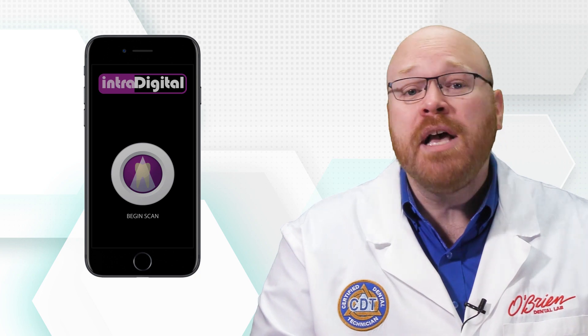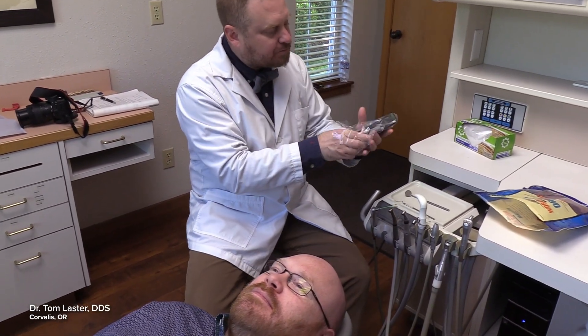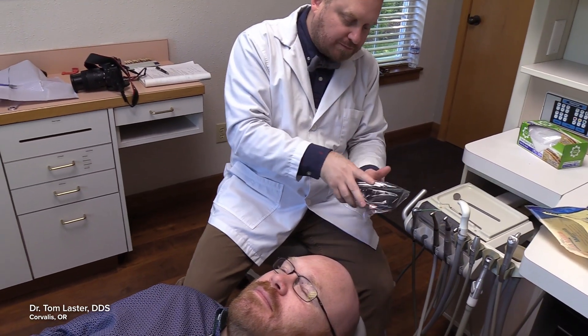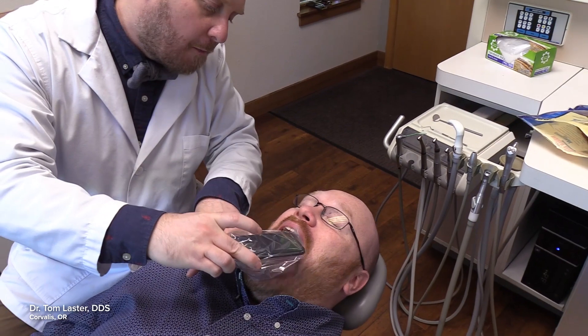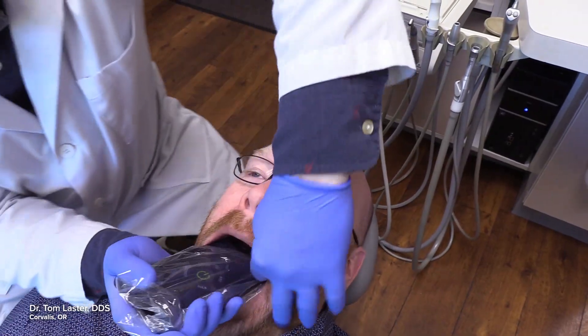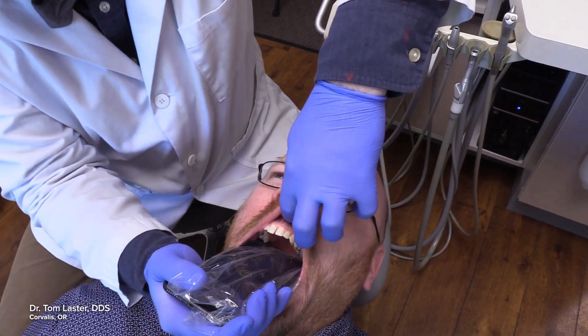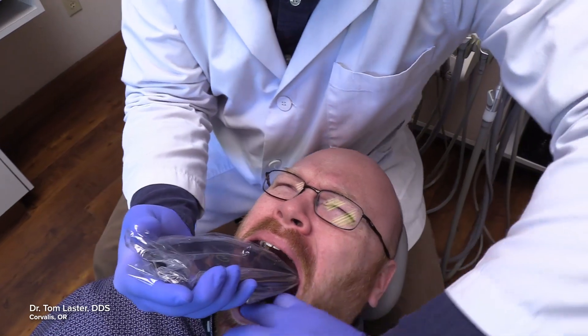After you've installed the Intradigital app, you're ready to begin the scanning process. Start by covering the phone with one of the Intradigital barrier sleeves. These sleeves are specially designed to fit all modern smartphones, and you can order them directly from the app. Next, simply touch the scan button, and you can start scanning the teeth extraorally. Then, to scan the prep, gently insert the phone into the oral cavity.